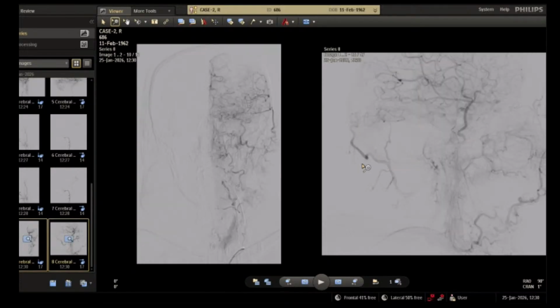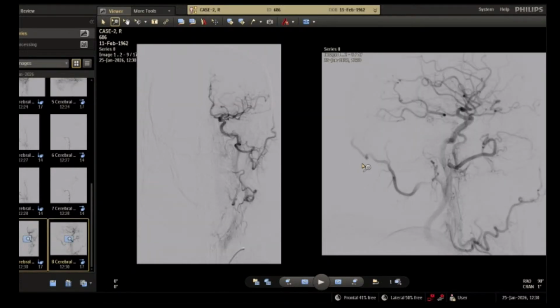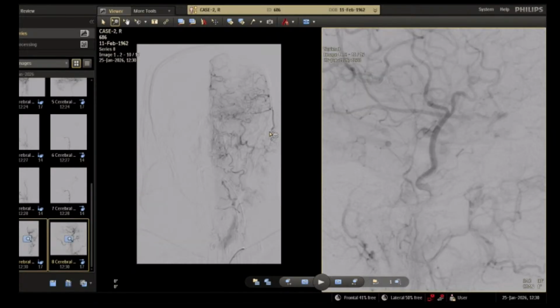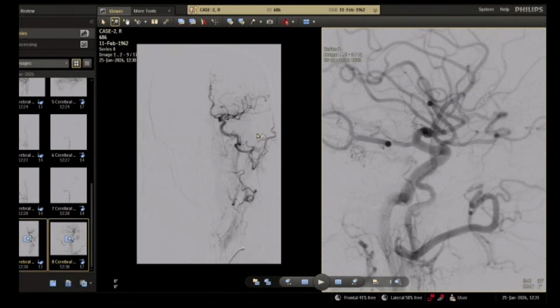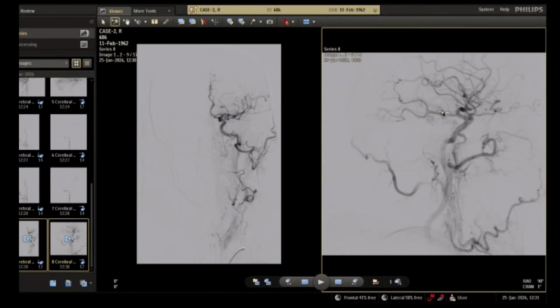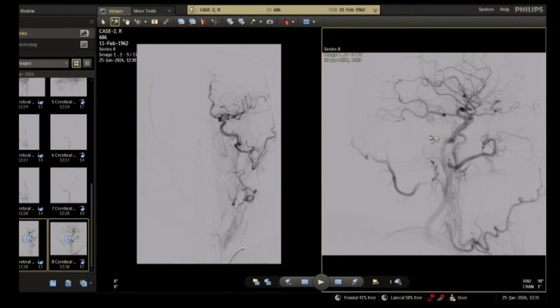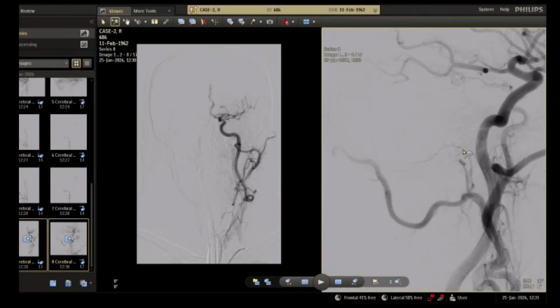There is the occipital artery enlarged, and this is the meningeal. This meningeal also goes from the ophthalmic. You can see it's coming from the ophthalmic artery. Yes, it's going from here. The ascending pharyngeal is, I think it's a branch of ascending pharyngeal.